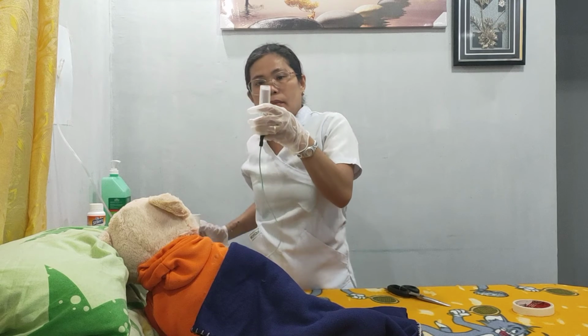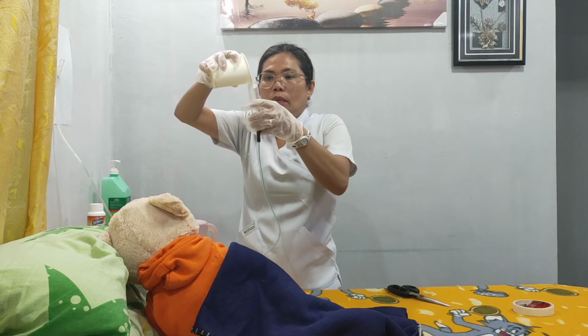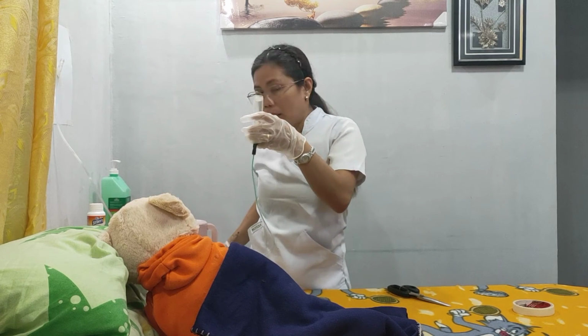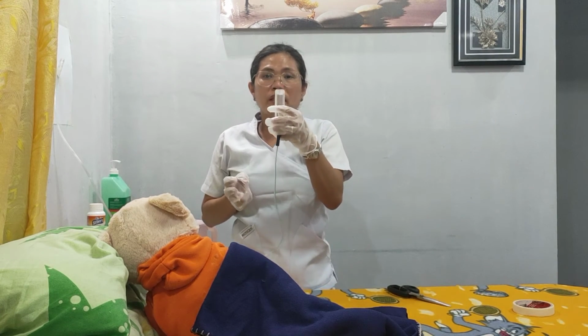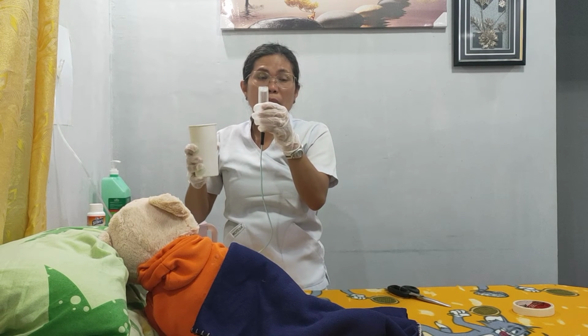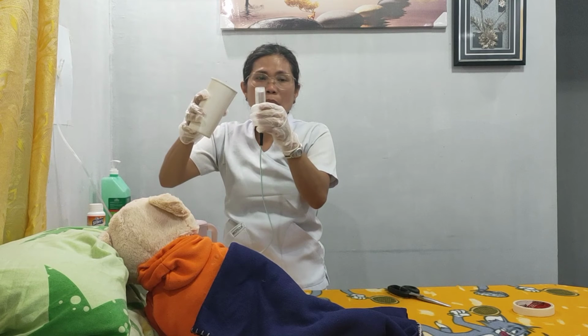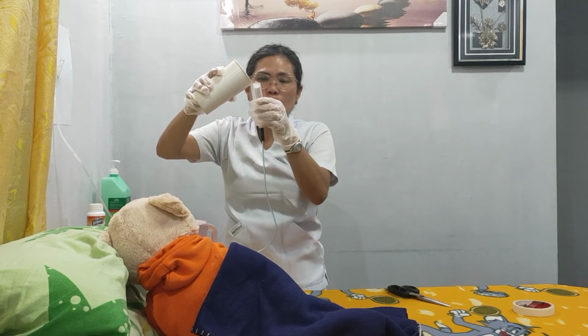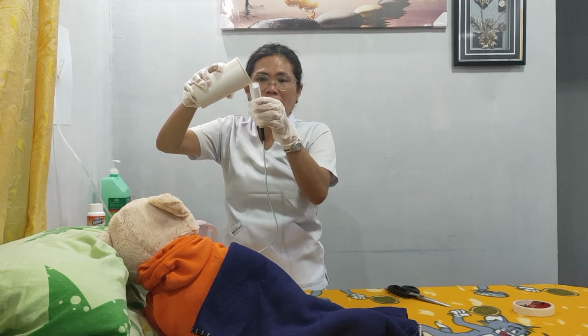Flush the tube with 20 ml of water or as prescribed. Feed according to the feeding schedule. Position the syringe slightly above the head and ensure the syringe is not empty during feeding. This is to minimize stomach discomfort due to excessive air entry.